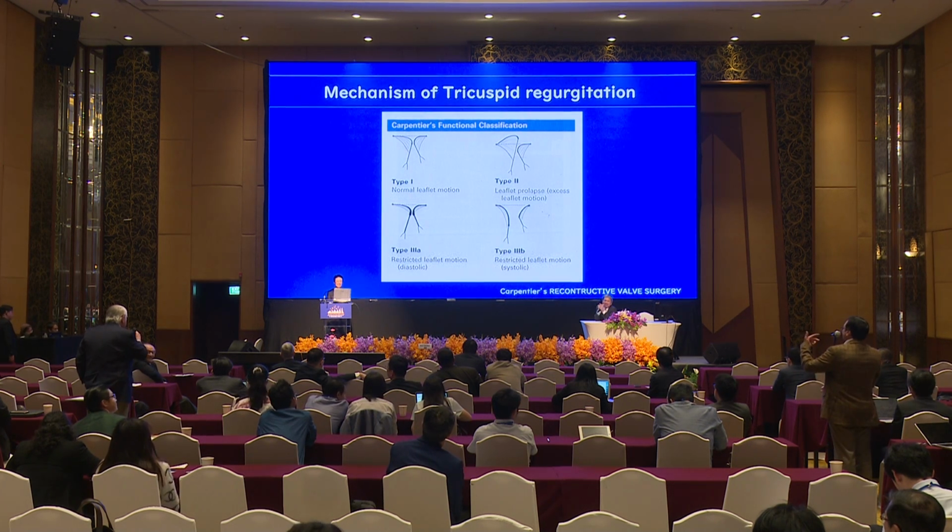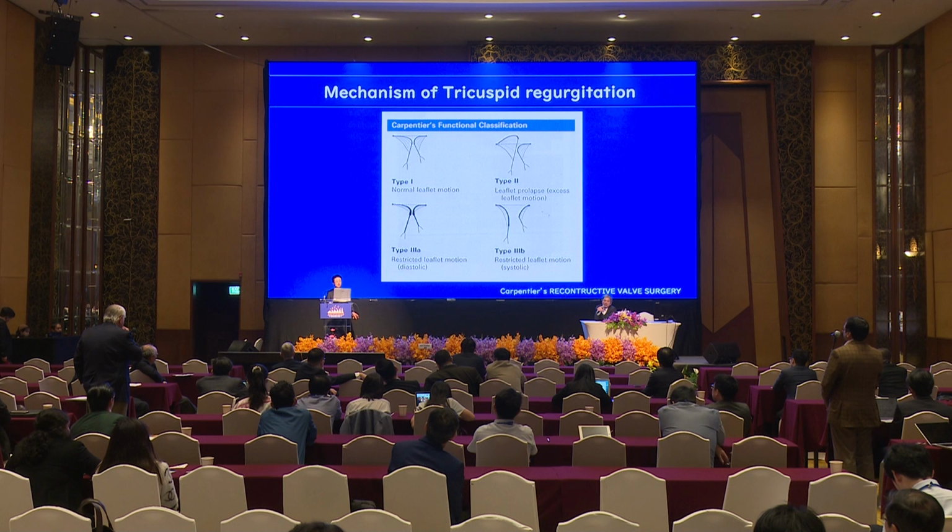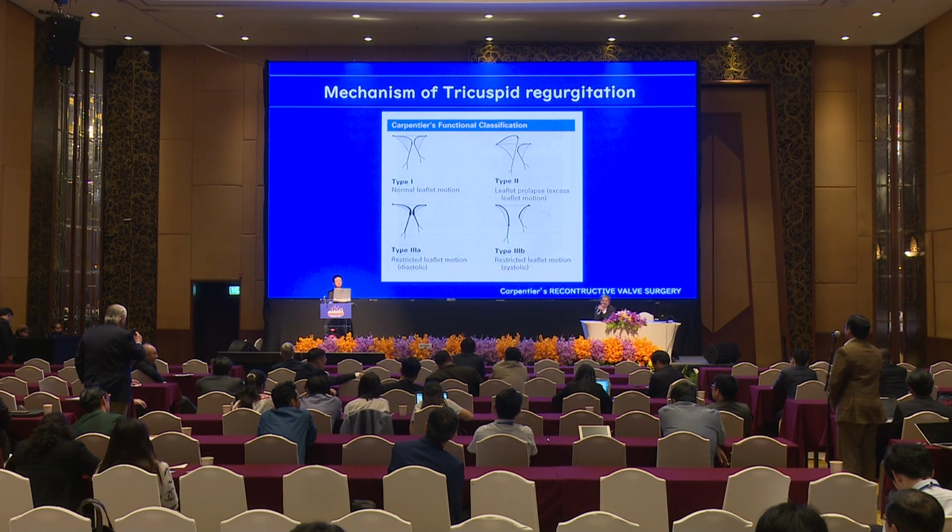Regarding the Gore-Tex patch and the pericardial patch, what will be your choice of patch if the pericardium is available? If there are no contraindications to using the Gore-Tex patch, I use a Gore-Tex patch. Yes. Thank you.